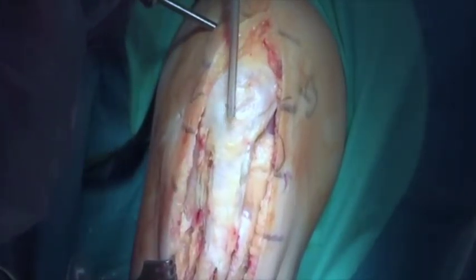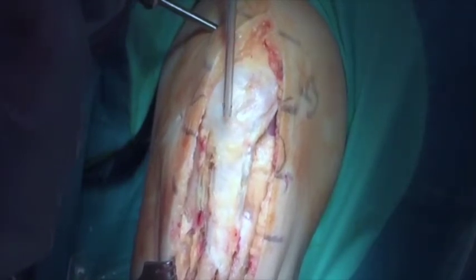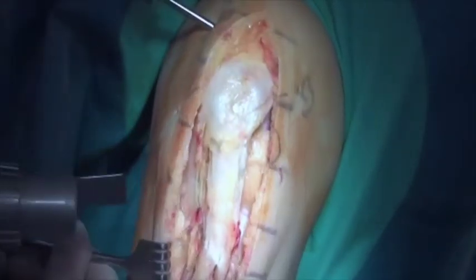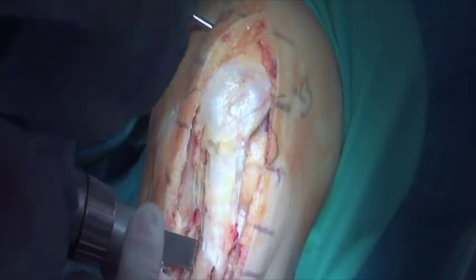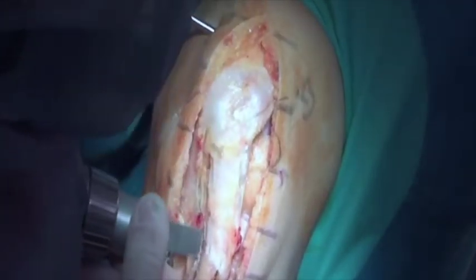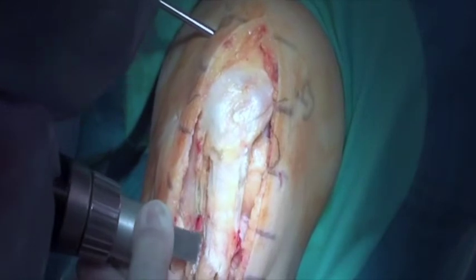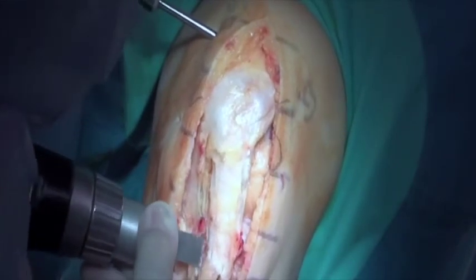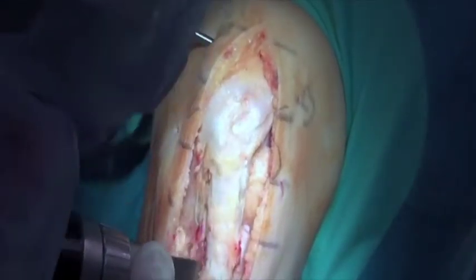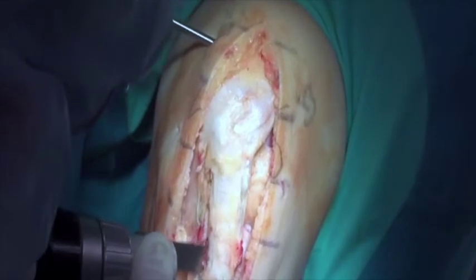The distal and lateral cuts are made approximately 1 centimeter in depth. The lateral cut is made at approximately a 45-degree angle. The anterior position is created by an oblique undercutting of the tibial tubercle, allowing for a combination of medial and anterior translation to the desired degree.